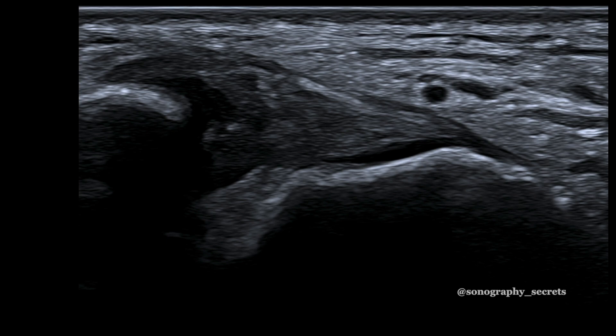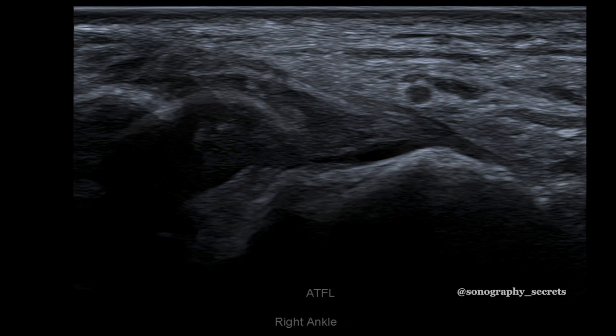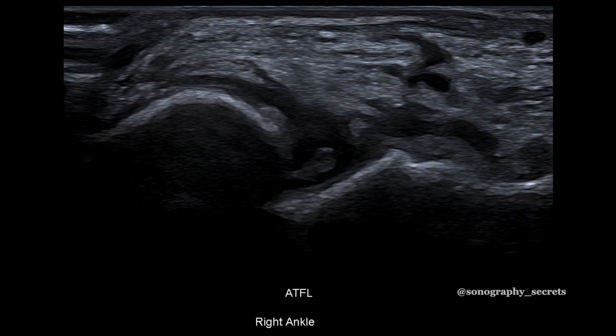Here is a partial tear of the ATFL. The most common finding of a partial ligament tear on ultrasound is thickening of the ligament, due to increased cellularity, fluid within the ligament tissue, and disorganized remodeling. A partial tear can also be hypoechoic, heterogeneous, and with non-uniform thickness across the joint, but the integrity of the ligament band across the joint remains.